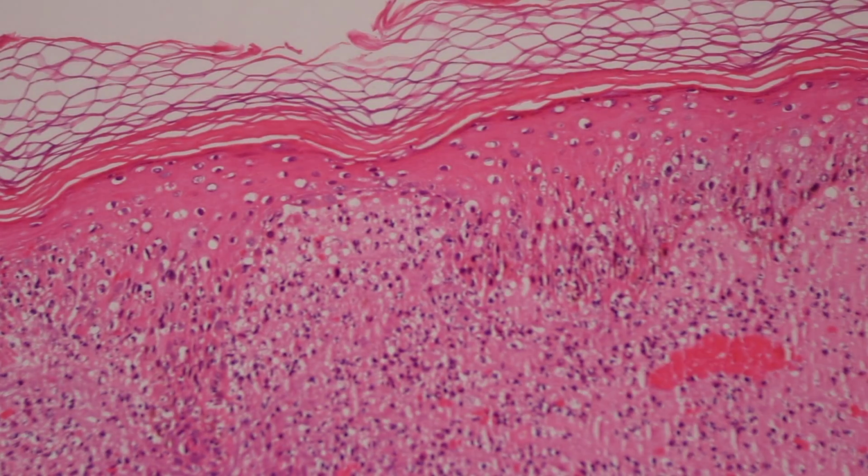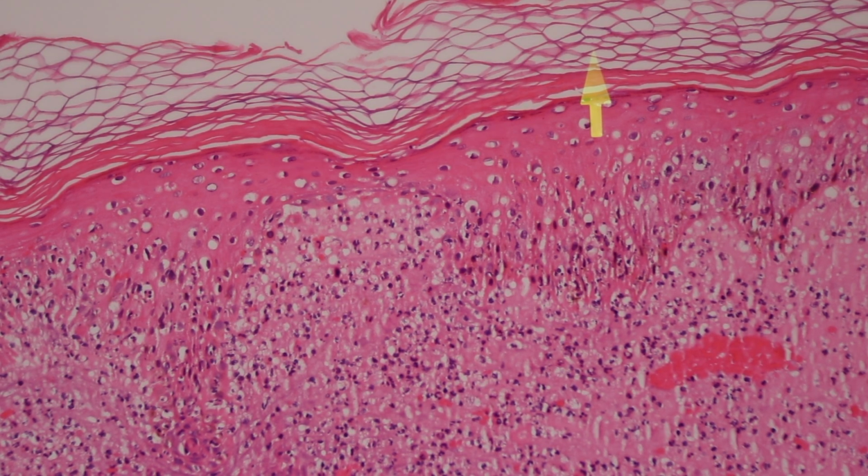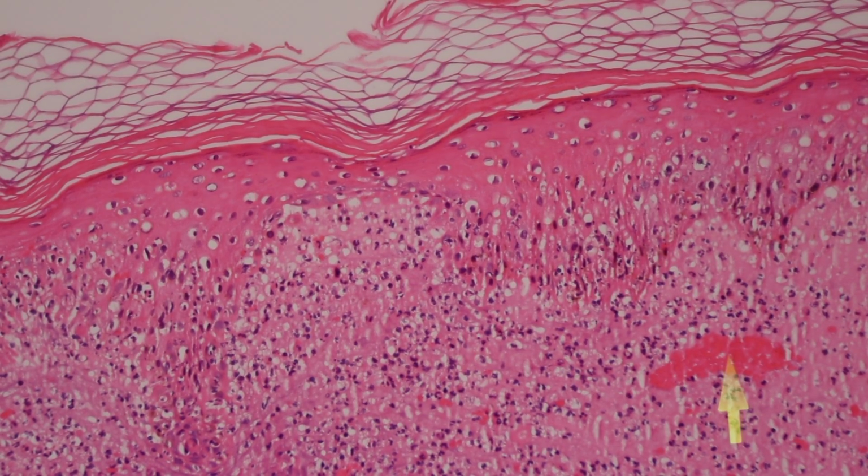Recognize this pallor and pale pink change, and the nuclei are starting to dissolve and wash out. These nuclei are still retained a little bit, but eventually they will all die and go away. And you can tell that this process happened relatively quickly because look, the corneal layer is still beautiful basket weave orthokeratosis, doesn't even have parakeratosis. There's nothing here to imply that this is a chronic process. It probably happened very quickly, and the epidermis didn't have any time to respond. It was just killed in action by the loss of blood flow.